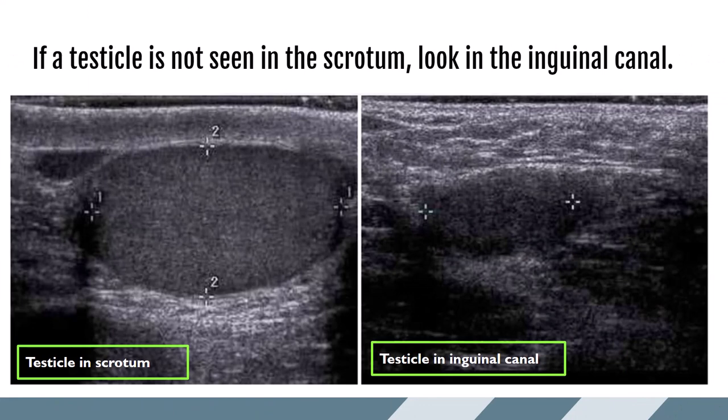If half of the scrotal sac appears empty, make sure you go and find the testicle. Often it will be up in the inguinal canal, which should be your first place to look. This image shows a normal testicle in the scrotum compared to a testicle found in the inguinal canal. Testicles in the inguinal canal are often more hypoechoic and considerably smaller.